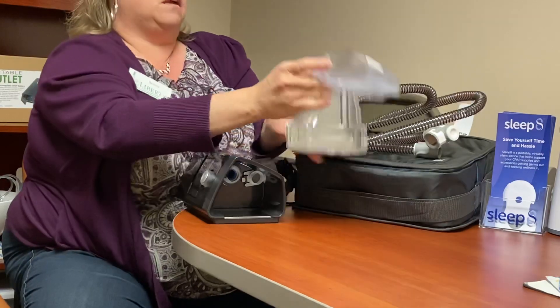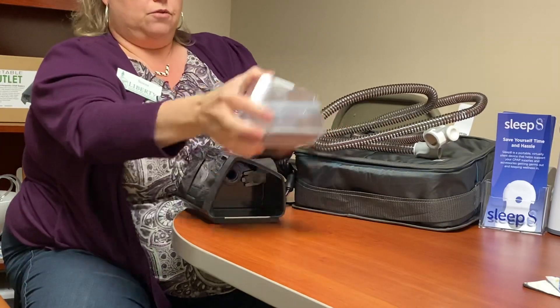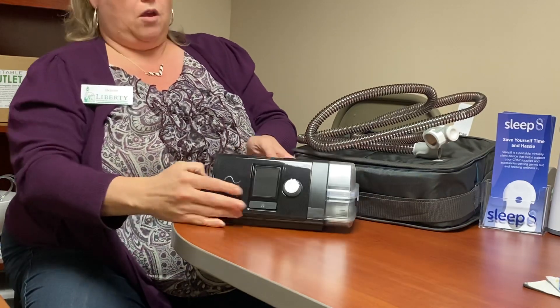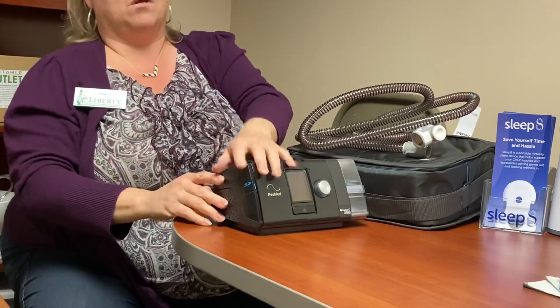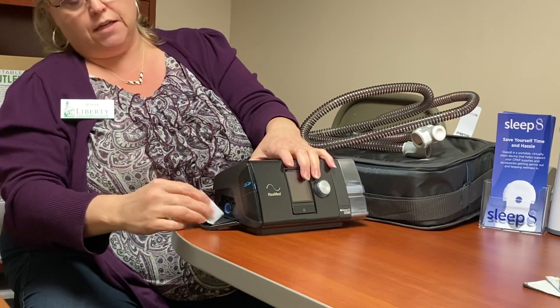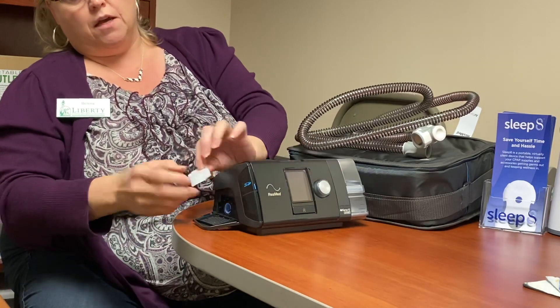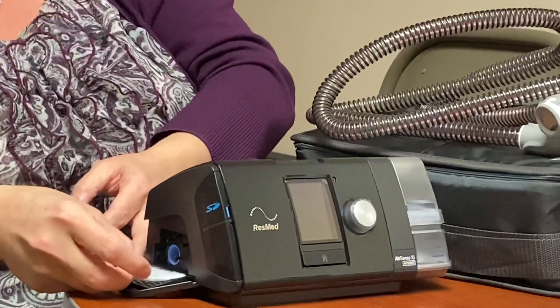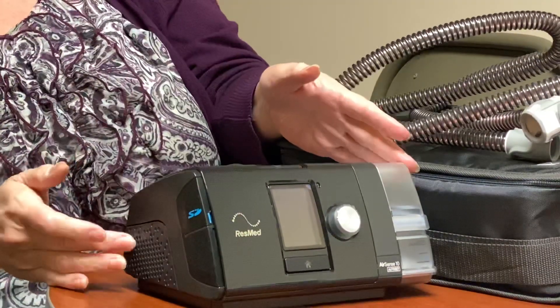Once a week you're going to need to do your cleaning by soaking all your supplies, and then once a month or every other week you're going to want to change your filter. On the side here is your filter compartment — it doesn't really matter which way this goes, you just set it in and shut the compartment.